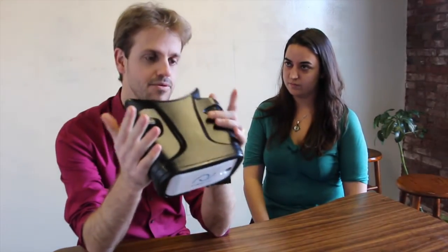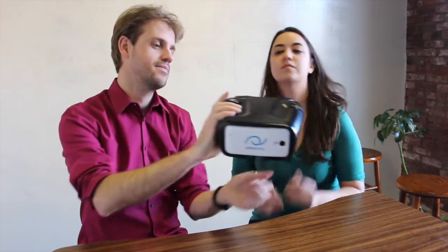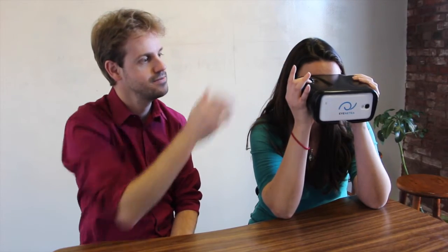Be sure to demonstrate proper grip and posture. The device should sit in the palms with the thumbs pointing upward, and the patient should be seated comfortably with his or her elbows propped up on a table for stability and support. Patients should be supervised during the test, and it is a good idea to verbally guide them through the first few repetitions until they appear confident.